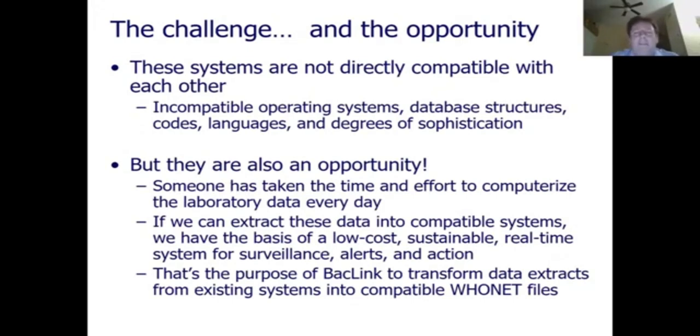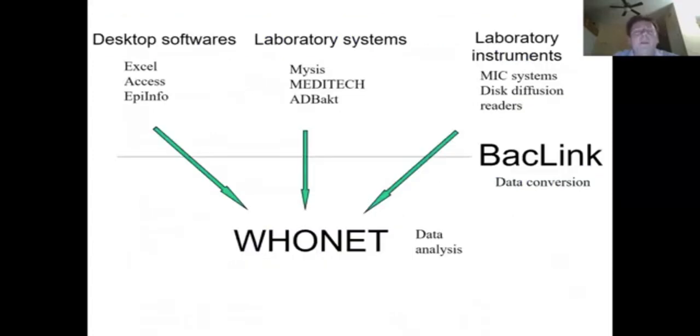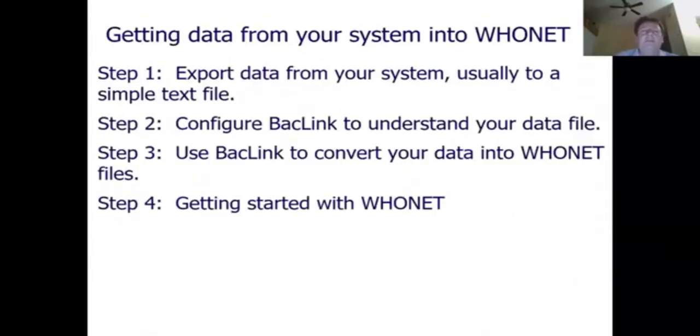Somebody took the time and effort to get the data into a computer. So if we can find a way to get the data out, then this is the basis of an excellent strategy for data management in real time to support local, national, and global surveillance. So that's the purpose of BacLink, to transform diverse data extracts into a compatible system. So BacLink is to convert the data into WHONET for analysis.